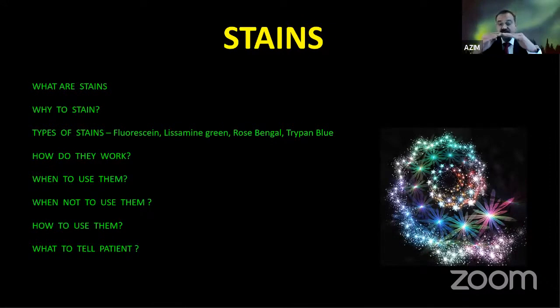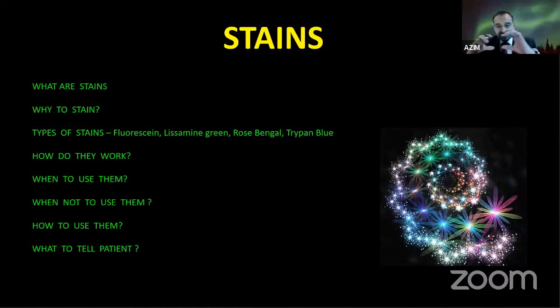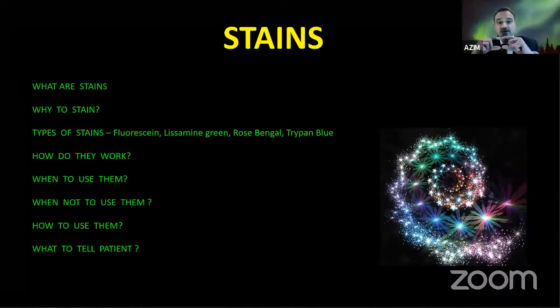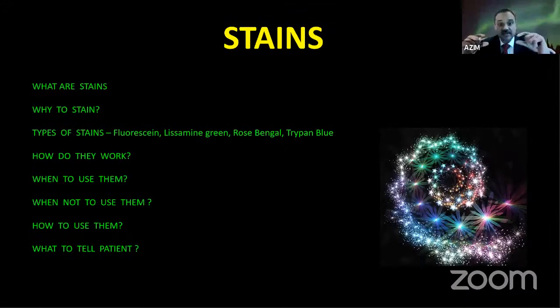Sometimes you may need a contrast. You see, when you do a histopathology slide, you put stains because without the contrast, you can't pick it up. Here we use stains as well, but these stains are called vital stains. So why are they called vital stains? Because you put them when the patient is still alive.